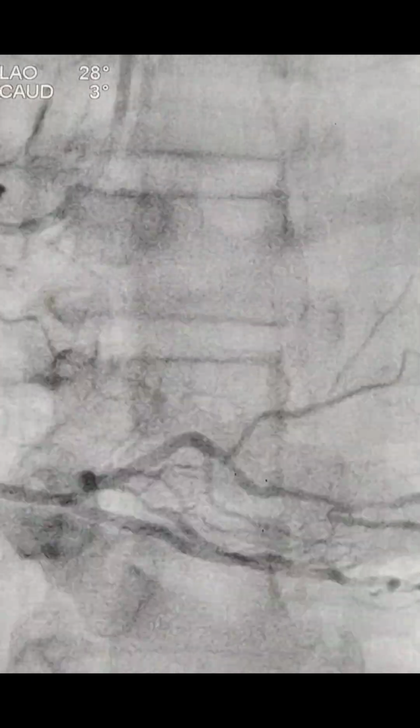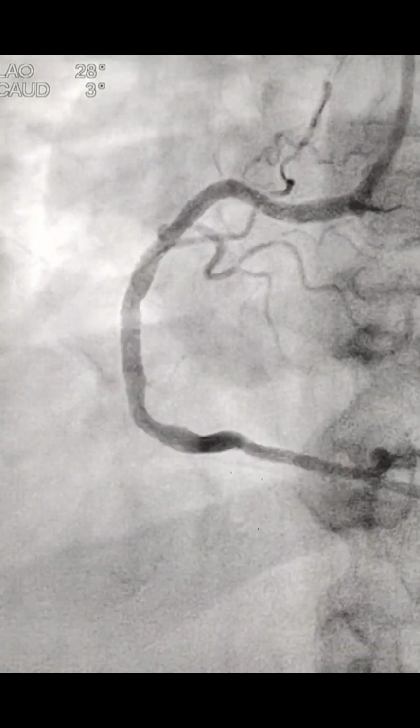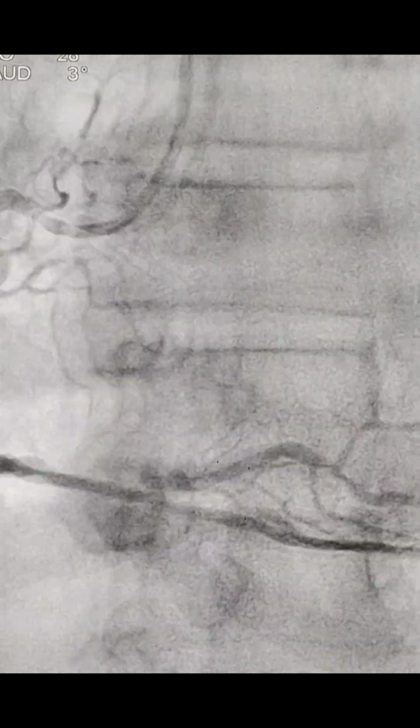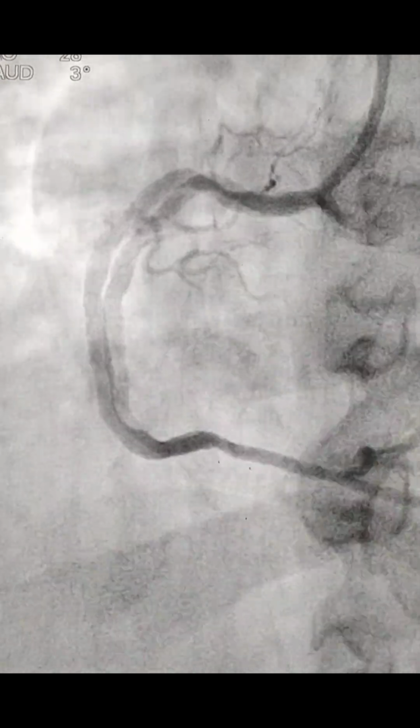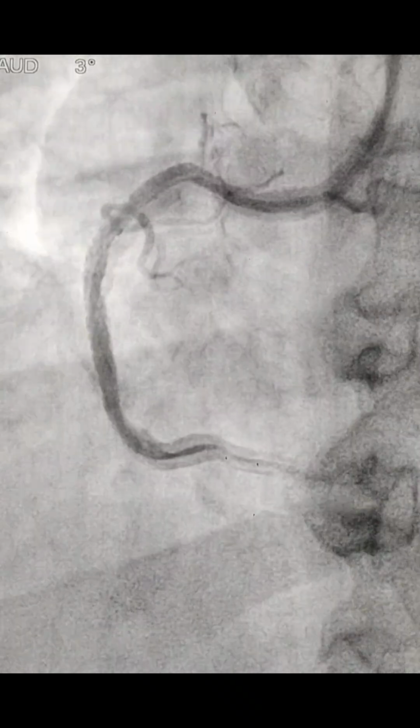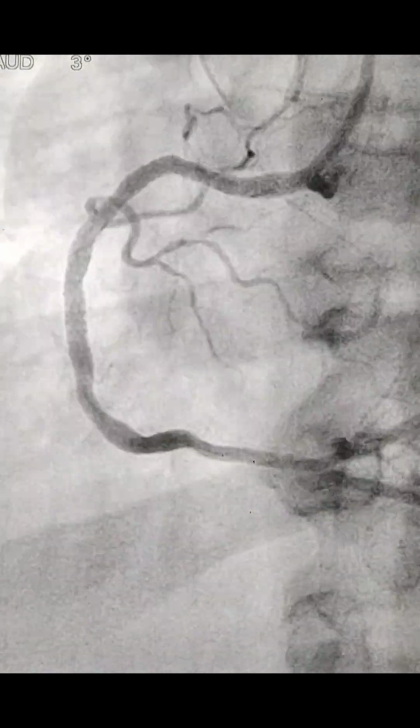And about this, at the proximal stent there was some under-expansion, probably that was the site where the occlusion was. Meanwhile the patient had 2 episodes of VT, so we gave tirofiban and nicorandil and everything, and then the patient was finally stable. BP came up, and the patient was shifted to ICU. So this was the angioplasty to the RCA, the totally occluded RCA.